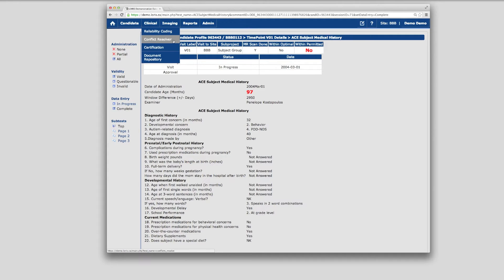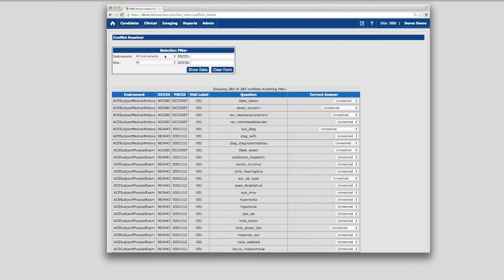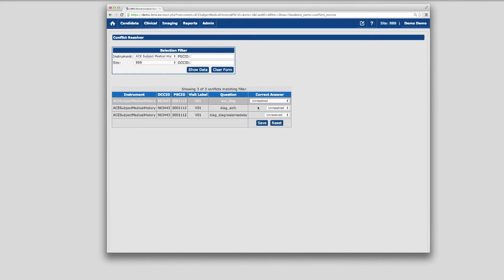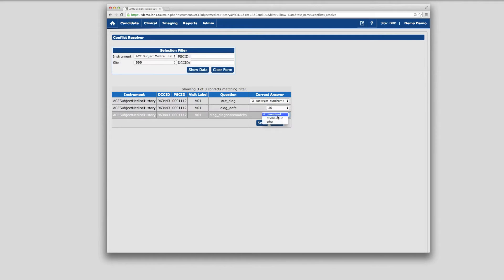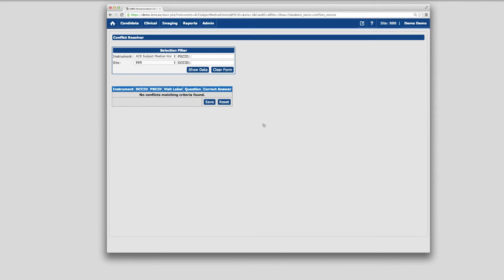Located under the Clinical menu, the Conflict Resolver module displays all double data entry conflicts and can be filtered by instrument or by site. This module enables users to resolve any data entry conflicts directly with just a few clicks, by selecting the correct answer for each data item. That covers double data entry and the Conflict Resolver — just a few of the features LORUS uses for quality control on the behavioral side.